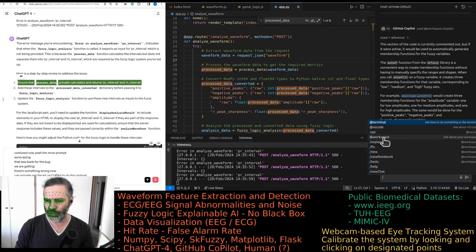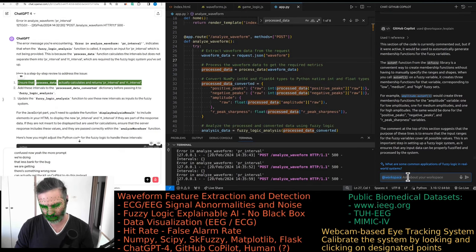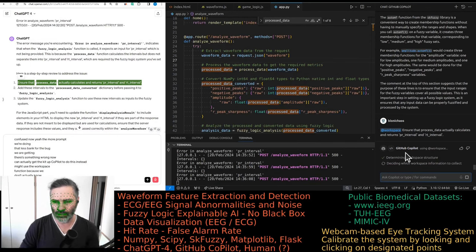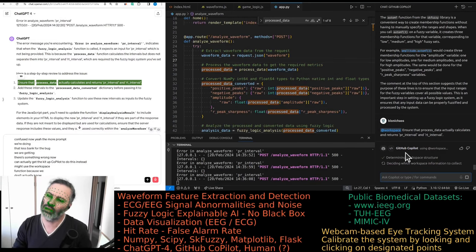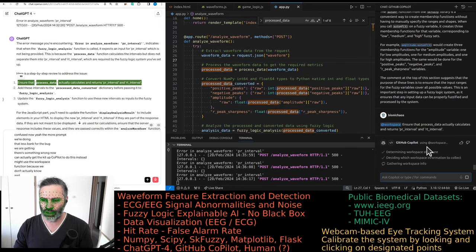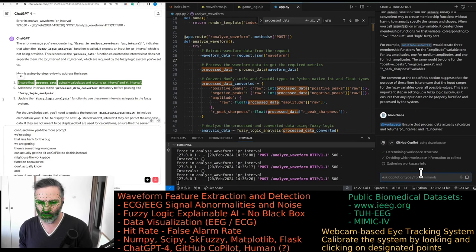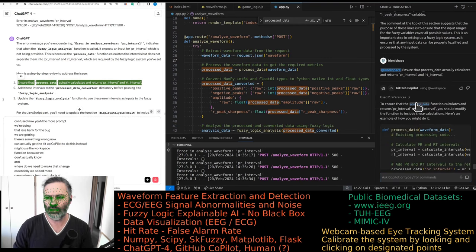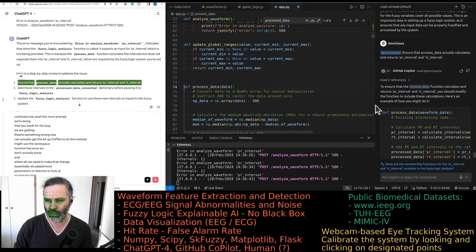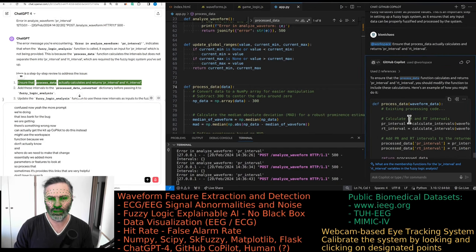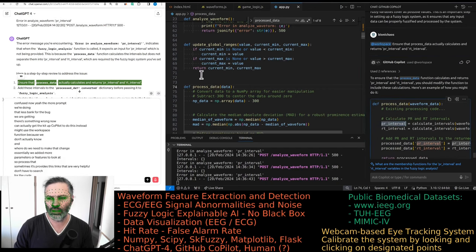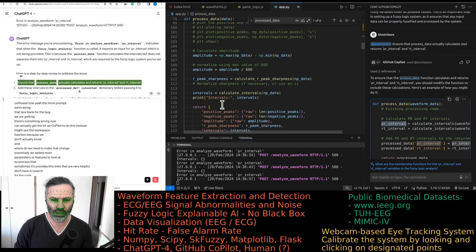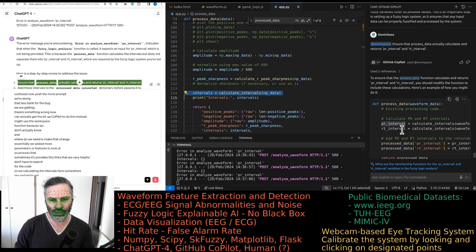There's something wrong now. Can we actually get the GitHub Copilot to do this instead? We might use the workspace function because we don't actually know where we need to make the change. Essentially we added more parameters, more features to look at. It's processed data. Sometimes it provides these links that are very helpful. So I don't have to search for the code. We're calculating the intervals here somewhere.